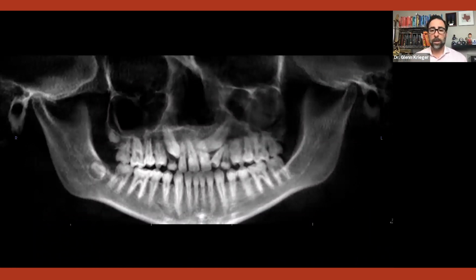We've got a tooth that looks to be coming in a weird position. It looks a little bit like a driver from golf or a club foot. But take a look at it, and you see what you've got here. And what are we going to do? He's got a retained upper primary cuspid, and that's a lateral incisor that's actually posterior to the cuspid.